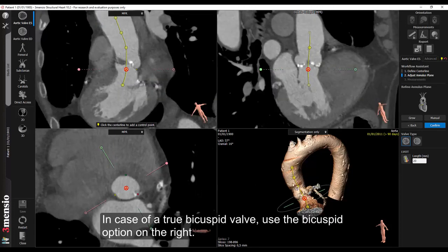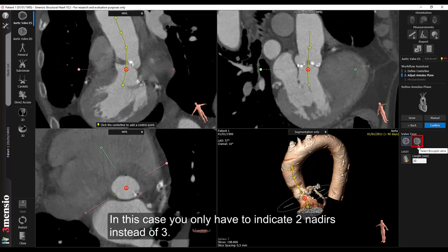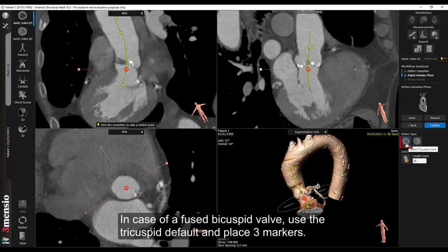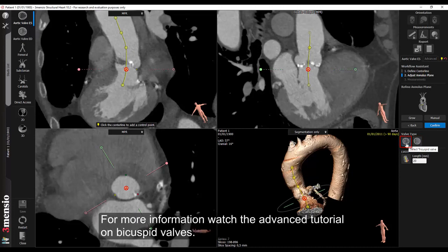In case of a true bicuspid valve, use the bicuspid option on the right. In this case, you only have to indicate two nadirs instead of three. In case of a fused bicuspid valve, use the tricuspid default and place three markers. For more information, watch the advanced tutorial on bicuspid valves.